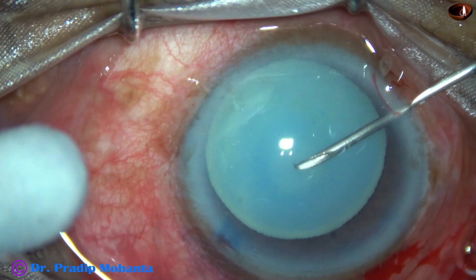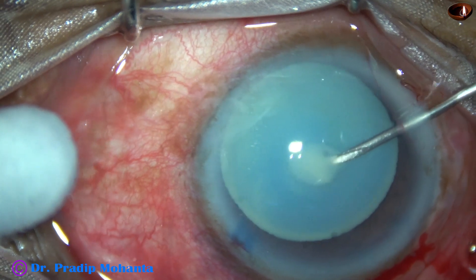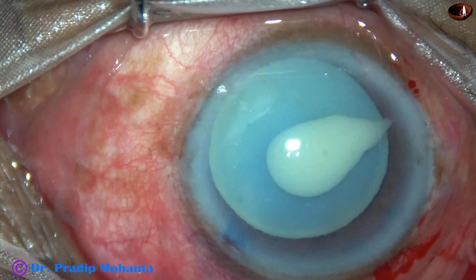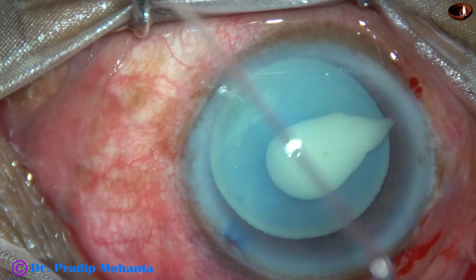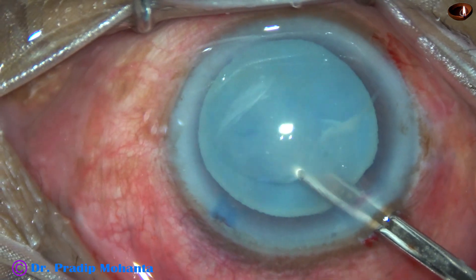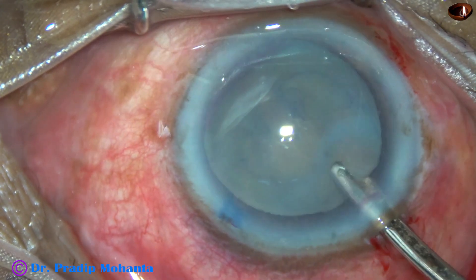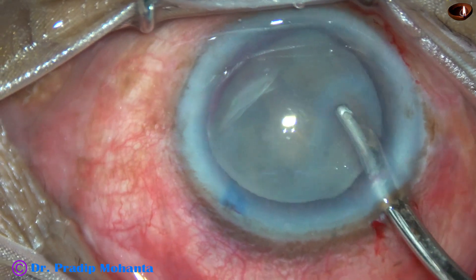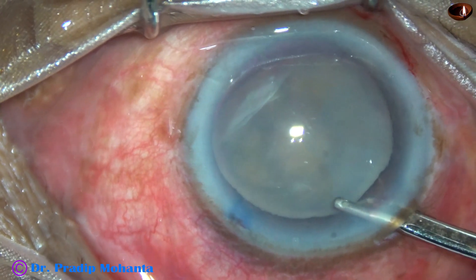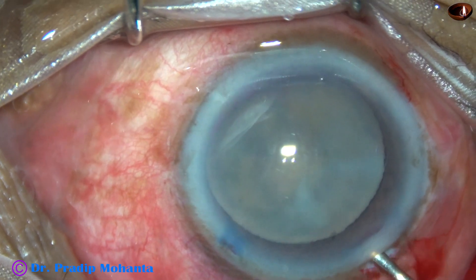As we make a puncture on the anterior capsule, if there is wrinkling of the anterior capsule, that means the zonule is weak — but it was not like that in this case. As soon as the anterior capsule has been punctured, there is a gush of milky fluid. And without converting the cut into a small rhexis, the milky fluid is aspirated. In hypermature morgagnian cataract, we can aspirate the milky fluid through the incision without doing a mini-rhexis.